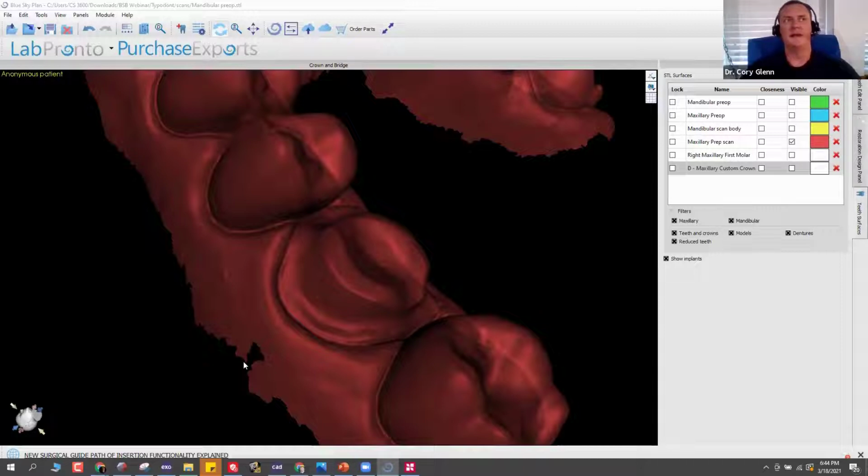The downside with the Form 3 is that it's using a single point laser to cure things, so it'll be a little slower. Some people say the prints are a little smoother because of that. But one pro that they have is, since all of their resins are verified and you only print their resins, I very rarely have a failure. So I would say either of those are a really great option. And then also SprintRay has the Pro 55, which is a smaller build plate size and just higher resolution.